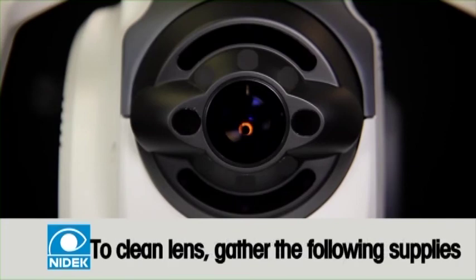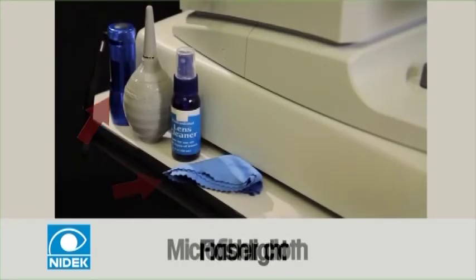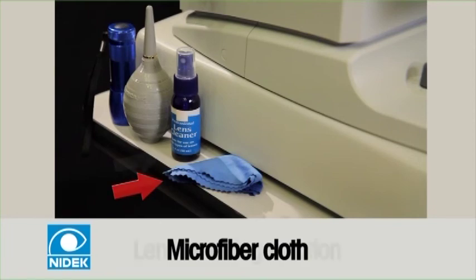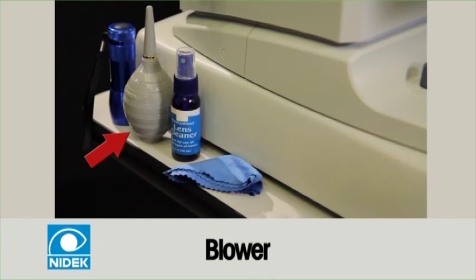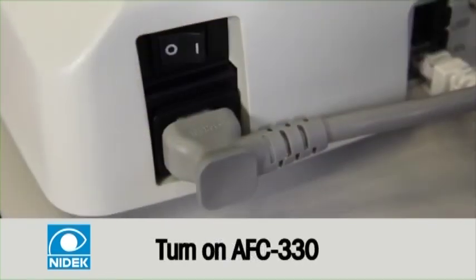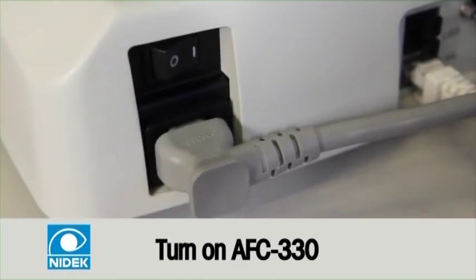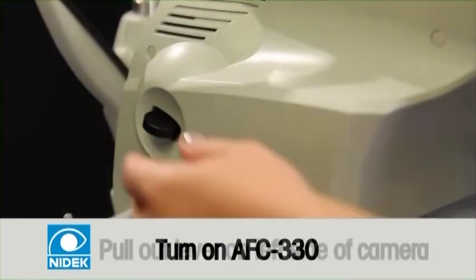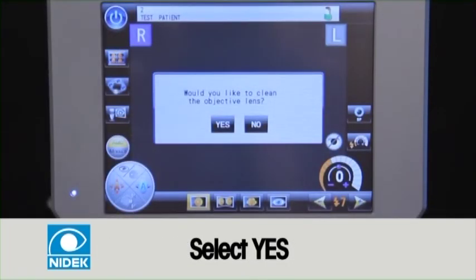To clean the objective lens, have the following supplies: flashlight or pen light, a microfiber cloth that is not being used to clean glasses, lens cleaning solution, and blower. To clean the lens, first turn on the AFC. Wait for unit to completely boot up. Then pull the lever out on the left side of the camera. A window will appear. Select yes.